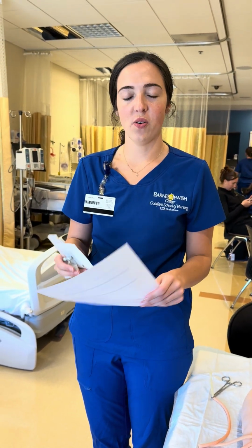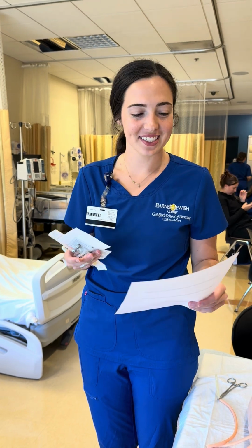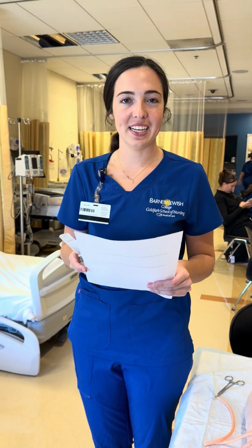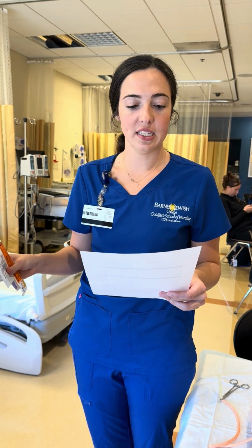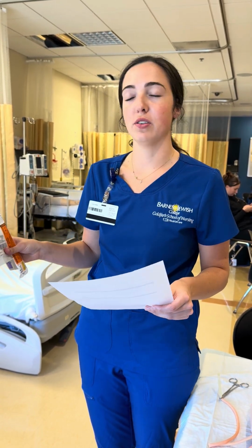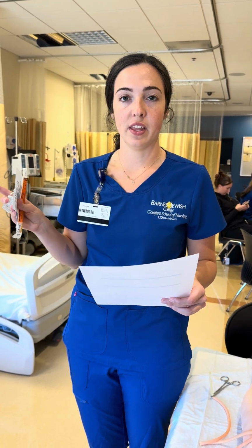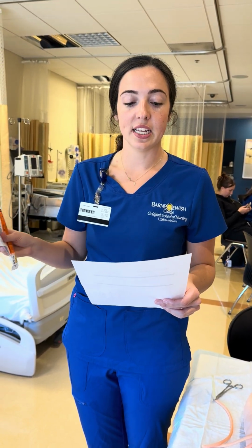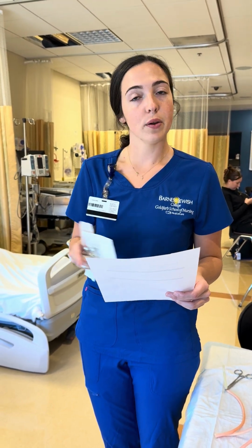All right, so I'm going to go ahead and verify my orders first. My order is that I have a patient who has come in with uncontrolled diabetes. What we're going to do is monitor their blood glucose level, and then give them 17 units of NPH and 7 units of the regular insulin subcutaneously. And we're going to do that right now.